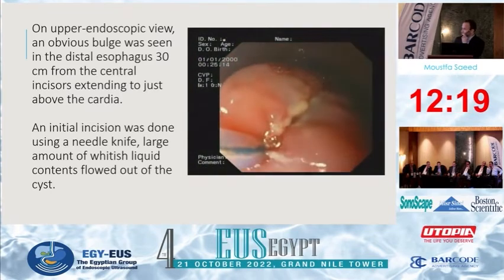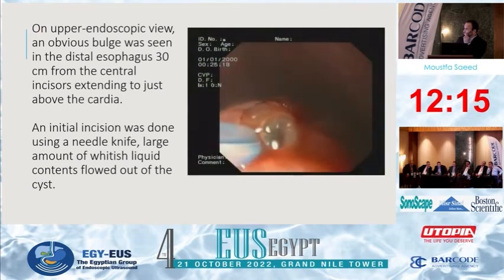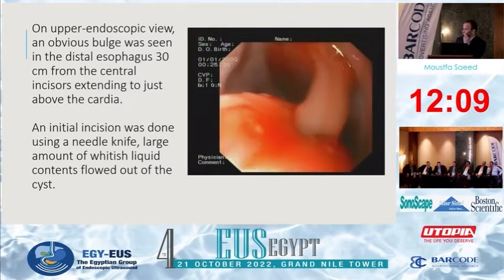Incision was done using the needle knife. After deepening the incision, a whitish fluid was coming out from the cyst.